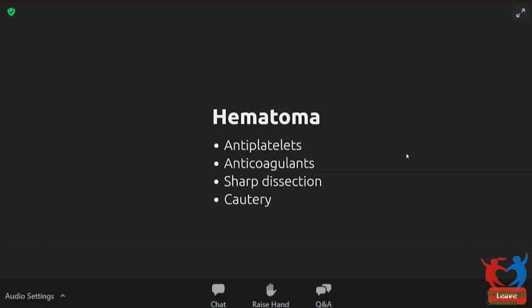So what we do is we screw it in and we check it. But suppose your threshold is 2 or 2.5, don't immediately unscrew and place in a new place. You wait for 2 minutes and then check it again. So that is one thing, an acute rise in threshold as soon as you screw in. Now, beyond that, the inflammation, that threshold rise progresses over a couple of weeks. So you can't really wait for that and check.